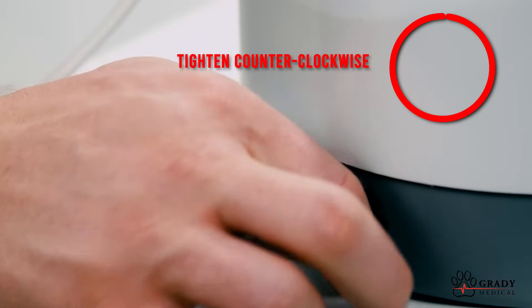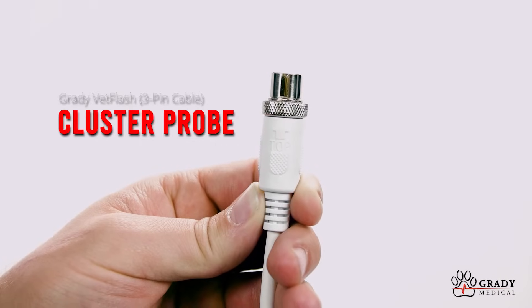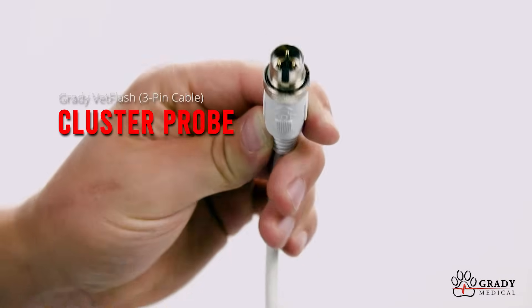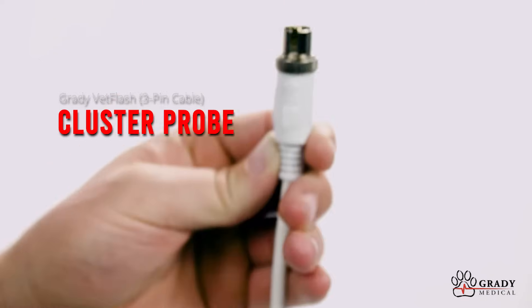Now we're simply going to tighten it down. The cluster probe has a three-pin plug. Go ahead and plug that in and we'll get started.